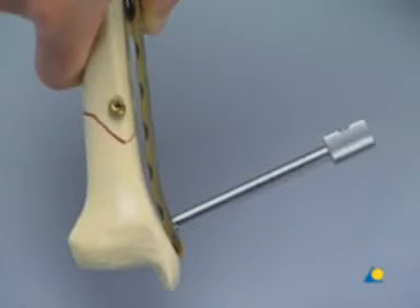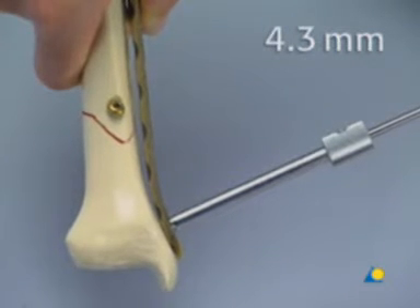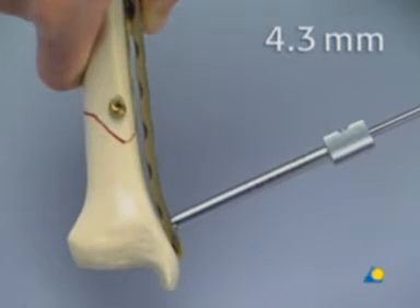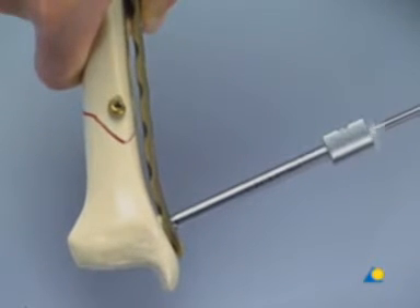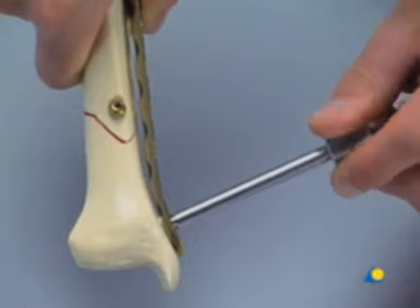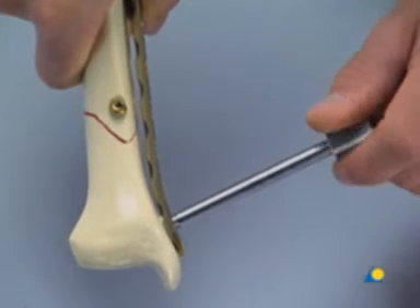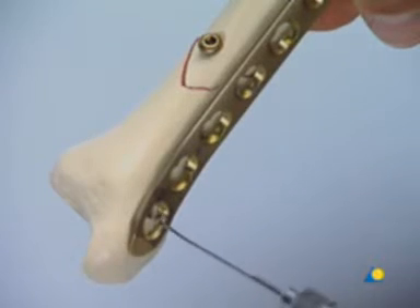The most distal hole is drilled with the 4.3 mm drill bit through the drill sleeve that has served as an insertion handle. The drill sleeve is removed and the length is measured with the depth gauge.